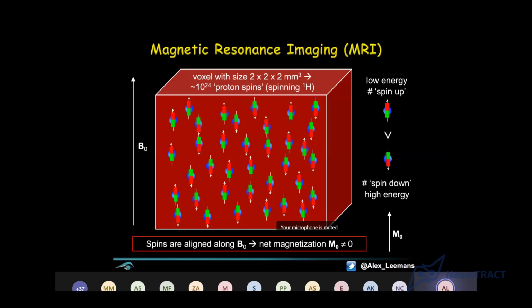Okay. So your body basically emits radio frequency, causing your net magnetization to ramp up again, right? So what basically happens is there are relaxation processes going on. This is called longitudinal relaxation. Then something else happens. Because of the precessing, your transverse component of magnetization is 0.